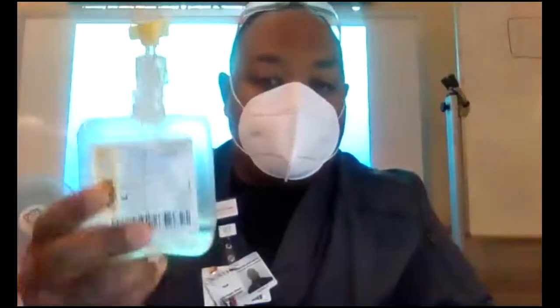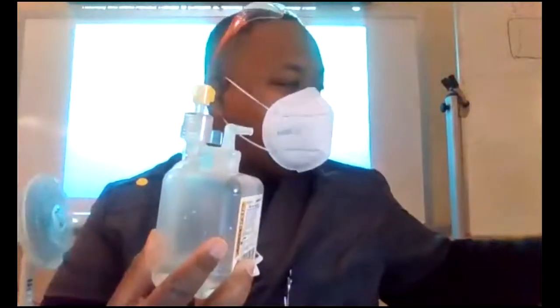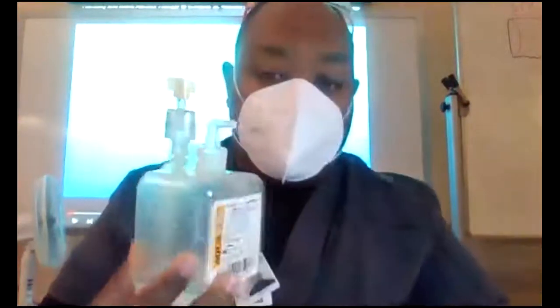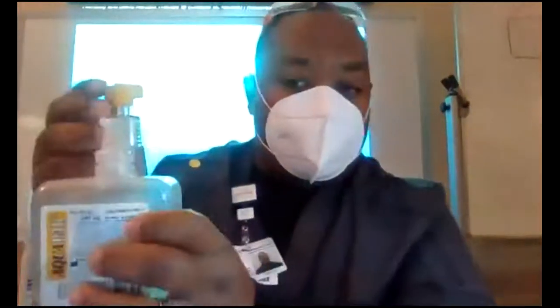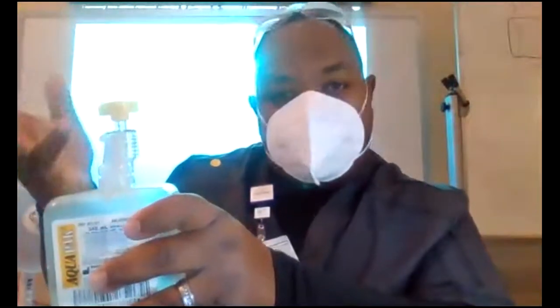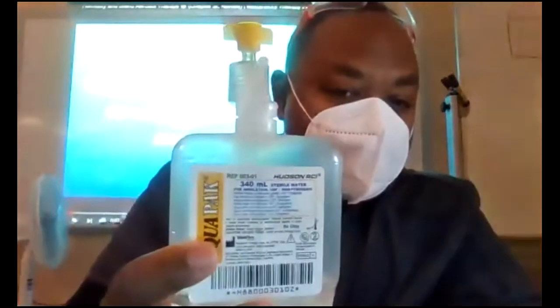This is a bubble humidifier, okay? The nasal cannula goes on here. You stick your nasal cannula on here and it goes to the patient, all right? I have my nasal cannula in here today, right? But this screws up to the flow meter. You screw this onto the flow meter, turn it on 2 liters, 3 liters, 4 liters, up to about 6, because that's where the nasal cannula goes to, right? And you put your nasal cannula on here and it goes to the patient.